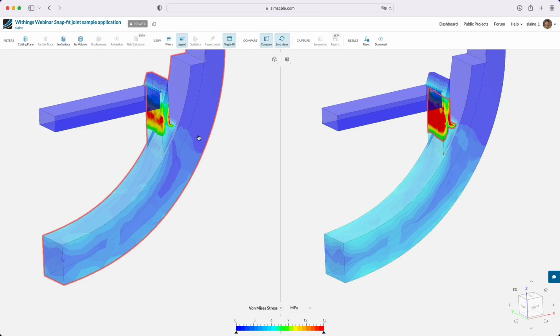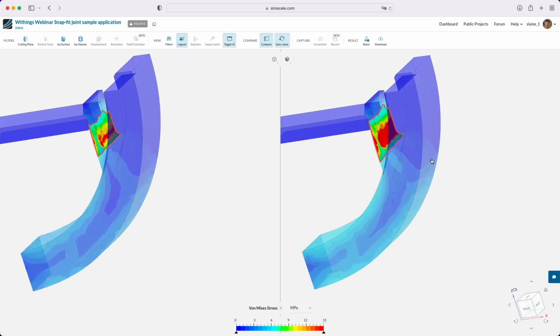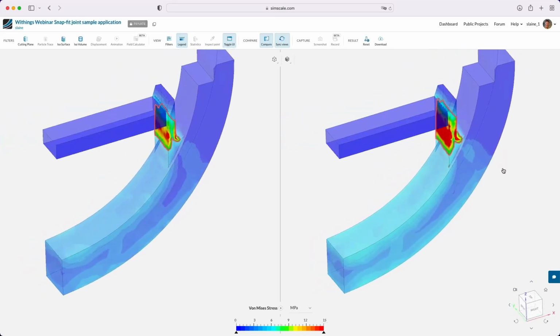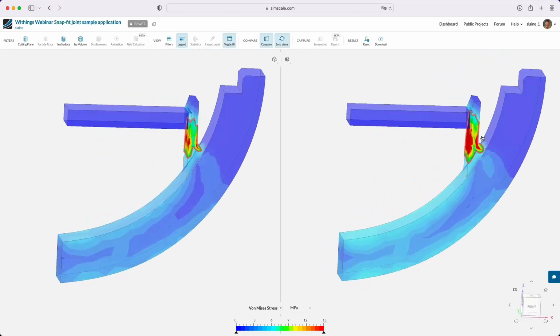Okay, so on the left we can see the nominal assembly, and on the right we can see the worst case scenario with a minus 0.1 millimeter assembly tolerance, and we can see a much larger stress region in the tang due to that assembly tolerance. So it's really great to be able to analyze these side by side and see how the two compare.